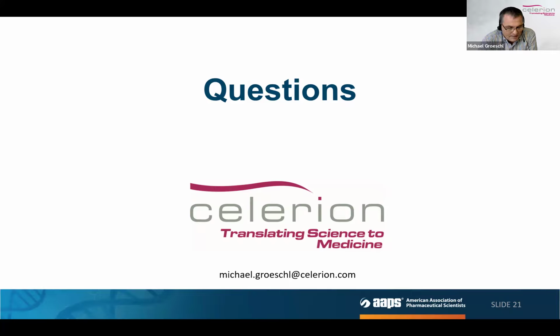Okay. That's great. Does saliva really have a future in bioanalytical studies? Yes, it depends on the analytical parameter. Again, some are proven, nicely published, so there everything is clear. For others, unknown drugs, if you want to run a PK study with your drug on saliva, of course you have first to see, can I recover the drug completely from the collection device?